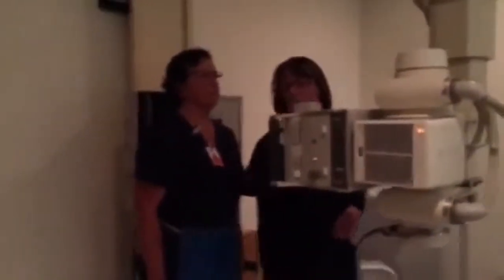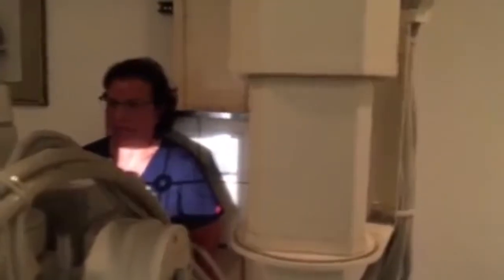Central ray is entering the same area, 1 inch inferior to the coracoid process. This time we're going to be doing an internal projection. So, Mrs. DeWitt, can you take the back of your hand and put it right about here. Let's take the back of the hand and place it right here.